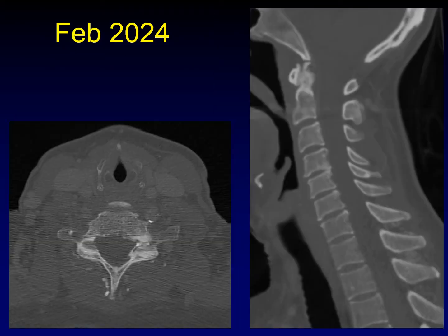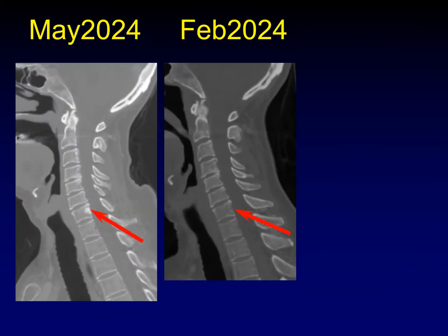We looked back to an examination from just three months earlier, and in that same vertebral body there is no evidence of sclerosis along the posterior margin. So what could be responsible for this sudden development of a sclerotic mass along the posterior vertebral body? What do you think is going on?